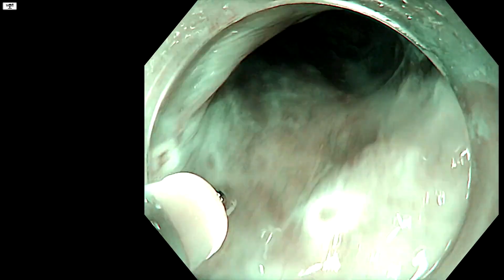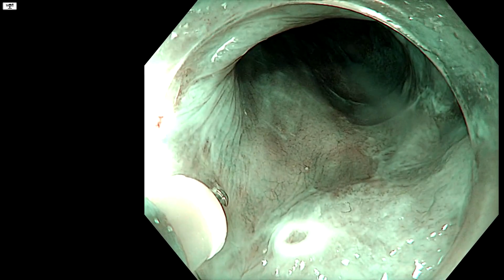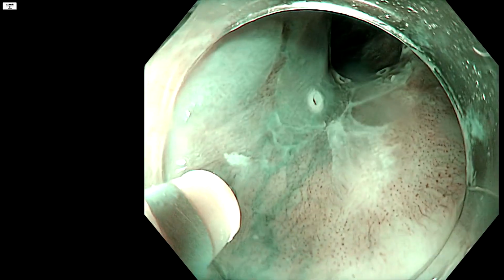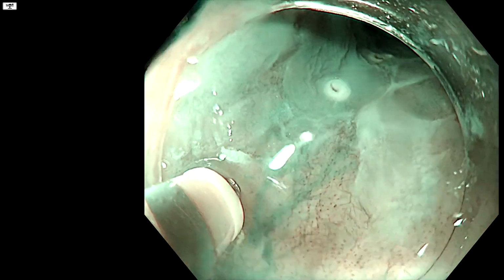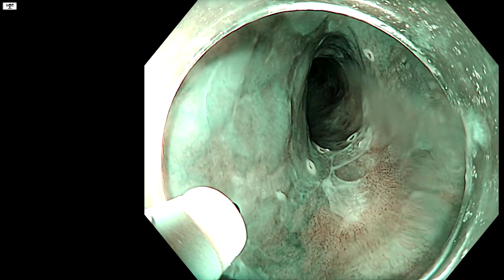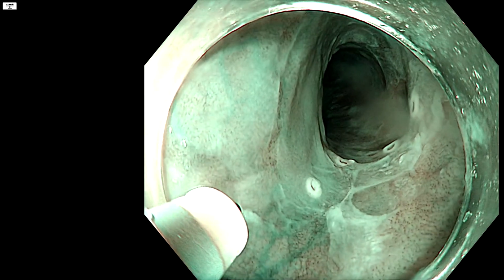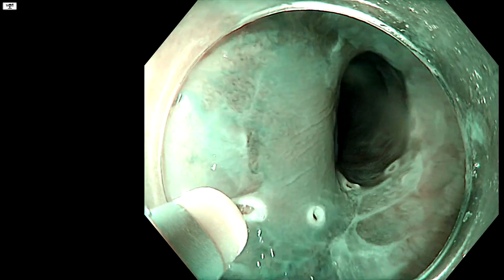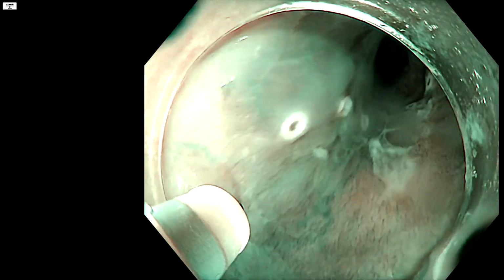And then let's go up this edge. So we'll go up here now. I think I see the edge here, but I need to back off it to be sure. And maybe we need to be wider here. Maybe this is something, but we're not going to take everything. And if we have something left, we can always come back and do it later.